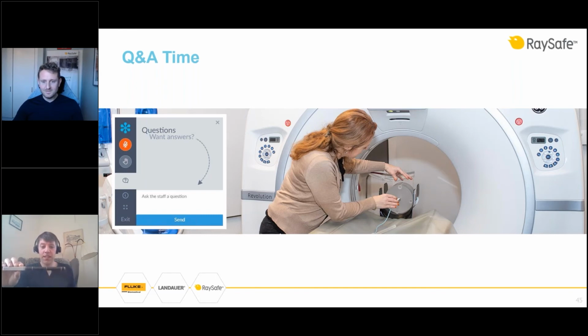What you do then is that you align, let's say the laser cross is here where my finger is, the edge of the active length with the laser cross so that you measure half the beam, and then you make an exposure. Then you move the chamber like this so that you capture the other half of the beam, and then you make another exposure, and then you add those two together.